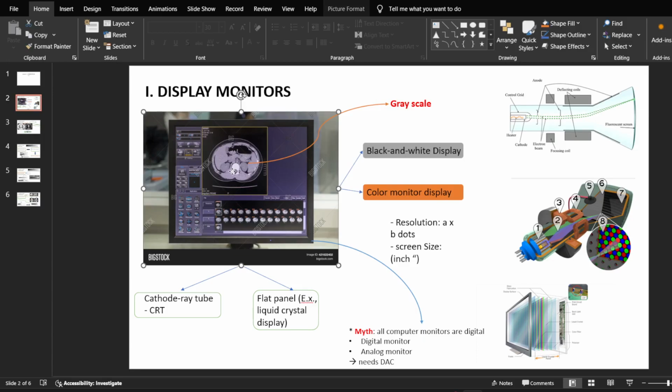As you may know, our CT image is a combination of many pixels, and every single pixel is labeled with a Hounsfield unit, and each Hounsfield unit will be labeled with a gray point on the gray scale.